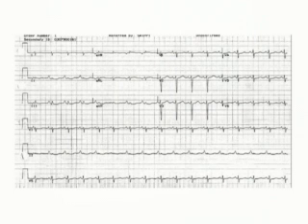This is an example. I'll ask you here, is the axis of the QRS normal or abnormal? It's abnormal, right? So we've got a QRS that's net negative in lead 1. It's net positive in AVF. It's even net positive in AVR. So this is very steep right axis deviation. Automatically you're thinking right ventricular hypertrophy, which is what this patient had.